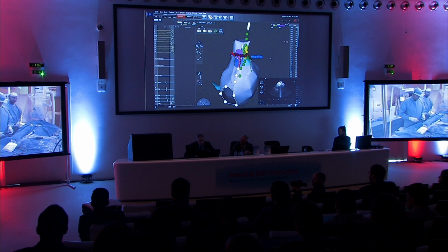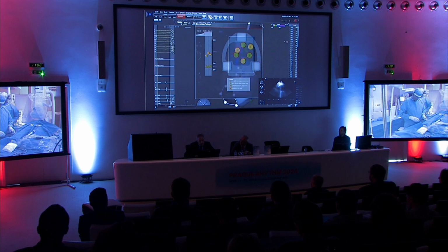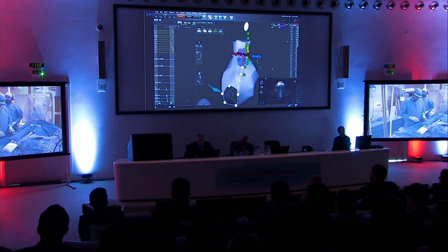Nobody knows exactly, but the scheme which was shown by Carlo Diasmundis exactly targets the upper part. I did maybe 25 years ago the first procedures for inappropriate sinus tachycardia, but with RF we were targeting this upper part during infusion of isoproterenol, ablating everything, and then you create a temporary effect and then it comes back again.